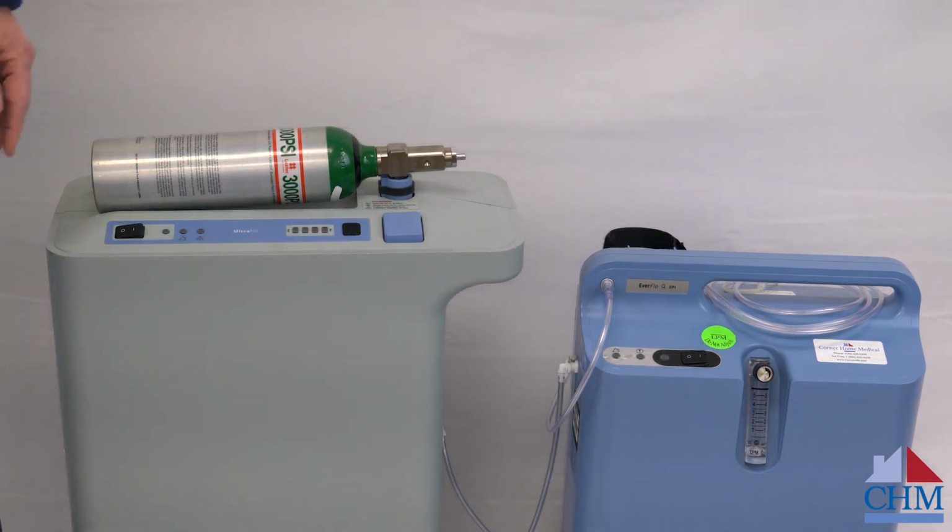It is able to pull in air out of the room, and it has the ability to absorb nitrogen. So as long as that machine is on and running, it keeps drawing in room air, absorbing nitrogen and pumping it back out into the room air, and then just leaving oxygen coming out.